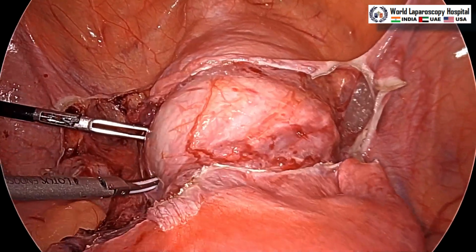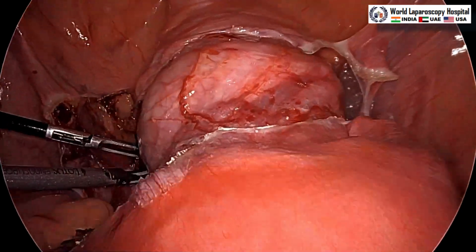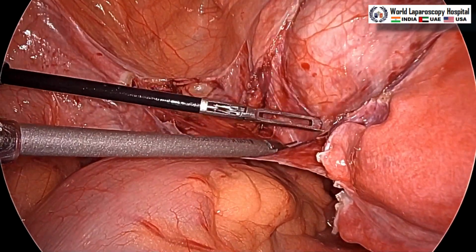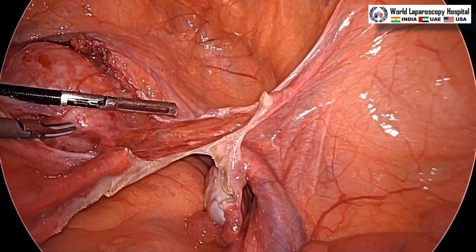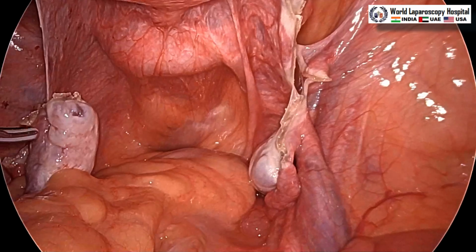So, lateralization of the bladder pillar is also over. You can see the vagina is visible like a pearly white background with a criss-cross pattern of vessels, and the bladder pillar is also lateralized on either side. This is important so that the uterine pedicle will be thin and you can coagulate.